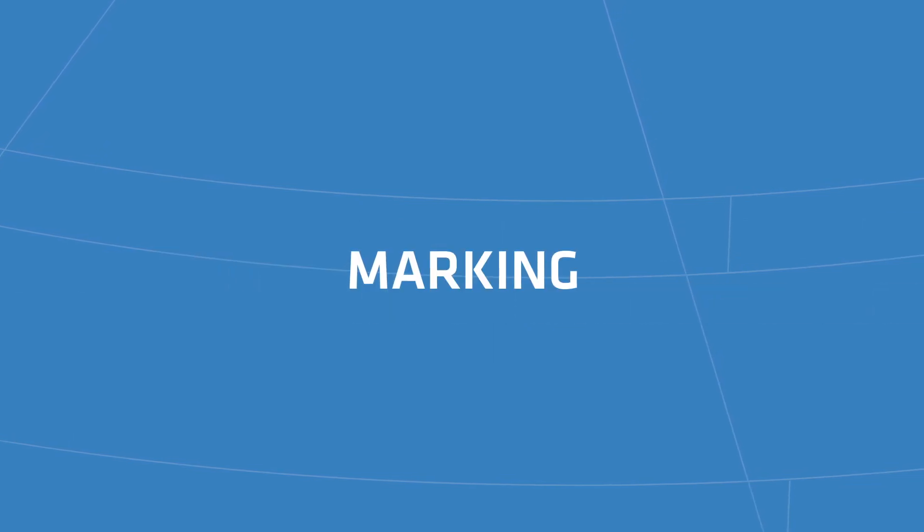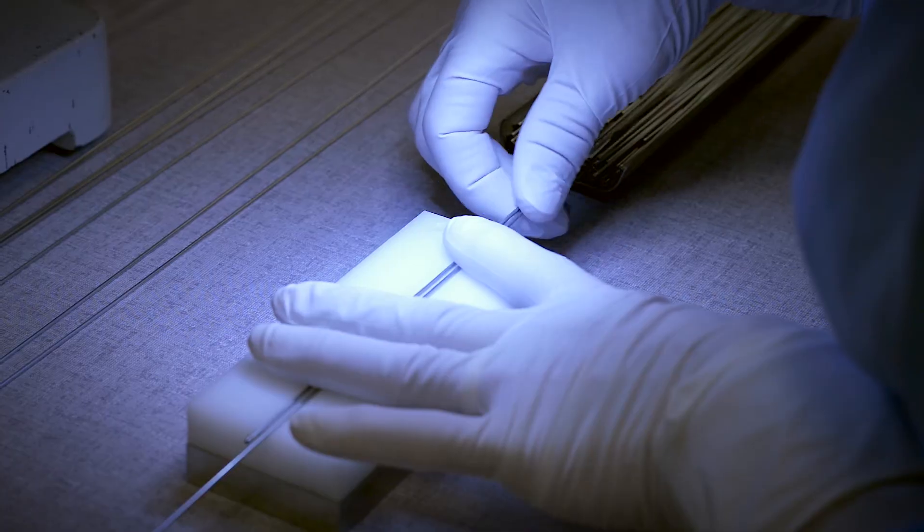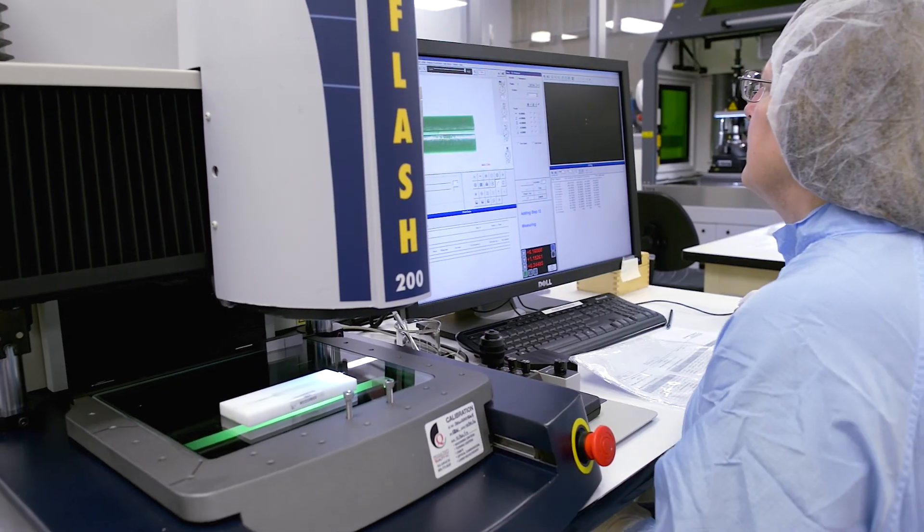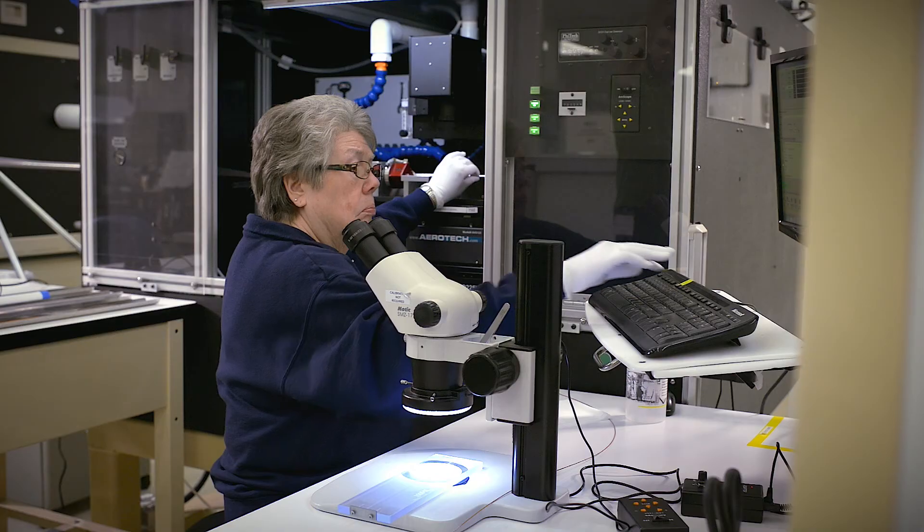Our secondary services are offered in your choice of class 10,000 or 100,000 clean rooms. We do assembly, including lining and heat-shrinking hypo tube, as well as electro polishing and passivating metal components.